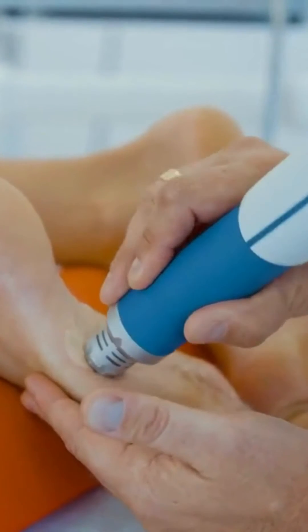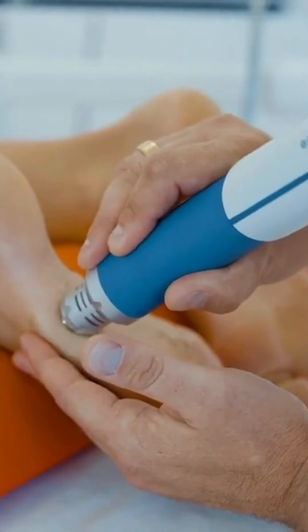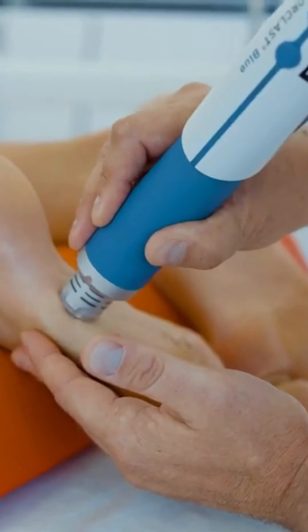Or over larger surfaces by gliding the applicator over the target tissue. You can use manual counter pressure to stabilize the handpiece during application.